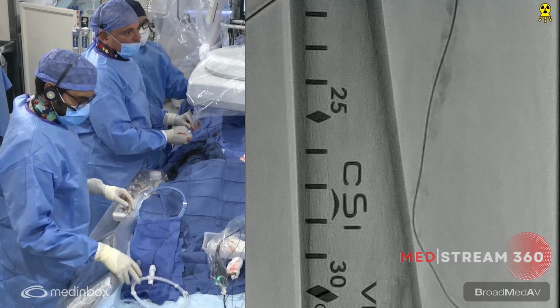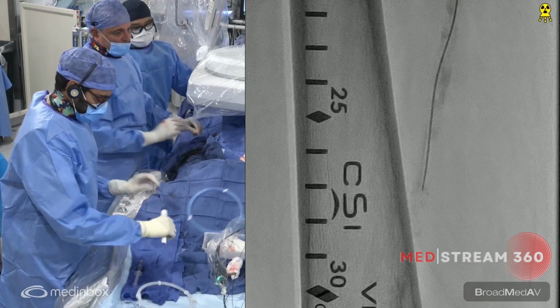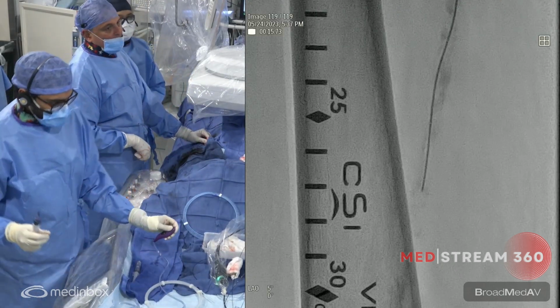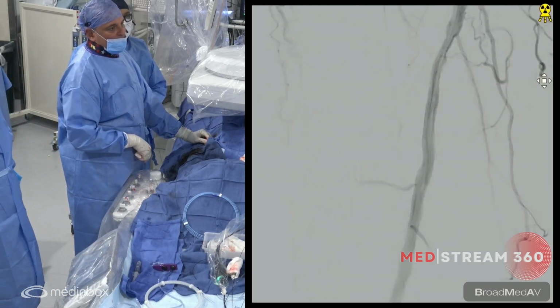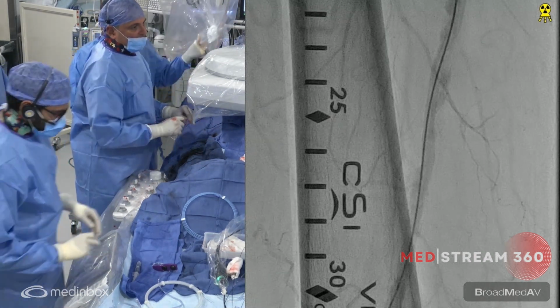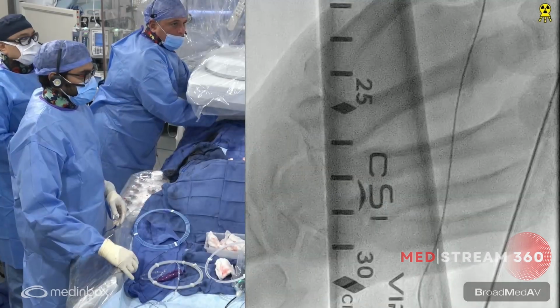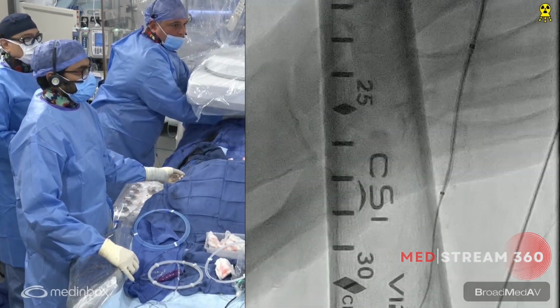So hopefully we will be able to get in. Just give me a little dig so I'm not too overconfident. Inject. So let's get the IVUS ready quickly. It's ready. Yep, we're clearly in the vessel, which I'm happy with. So now, yep, there you go. So now I'm going to track this catheter down. Wow. Oh, there you go. Nice. Okay, good.